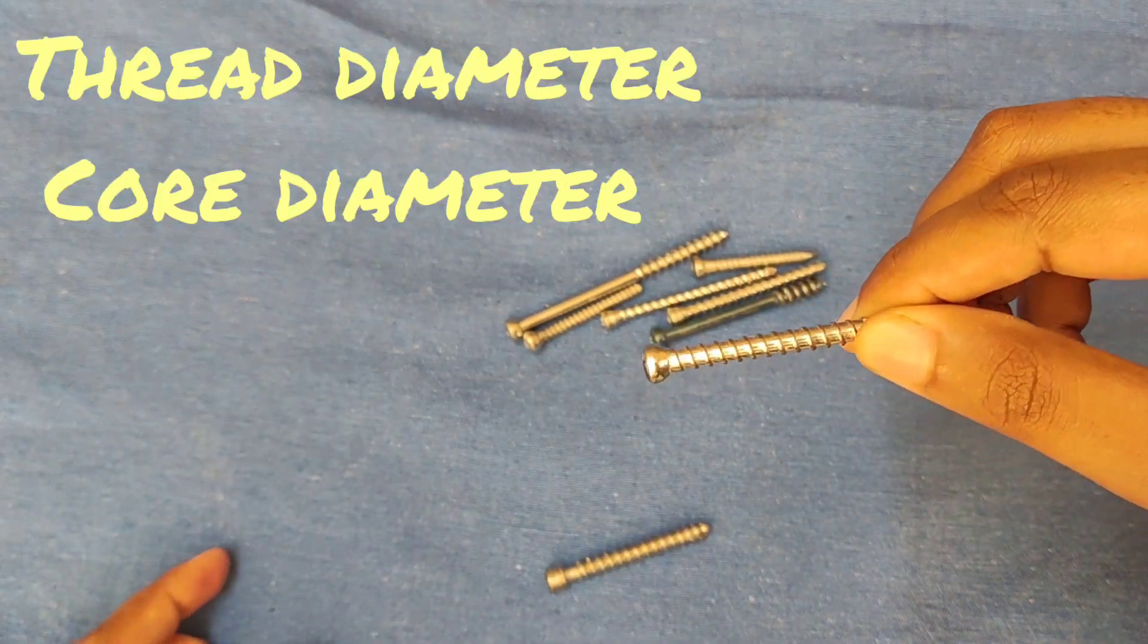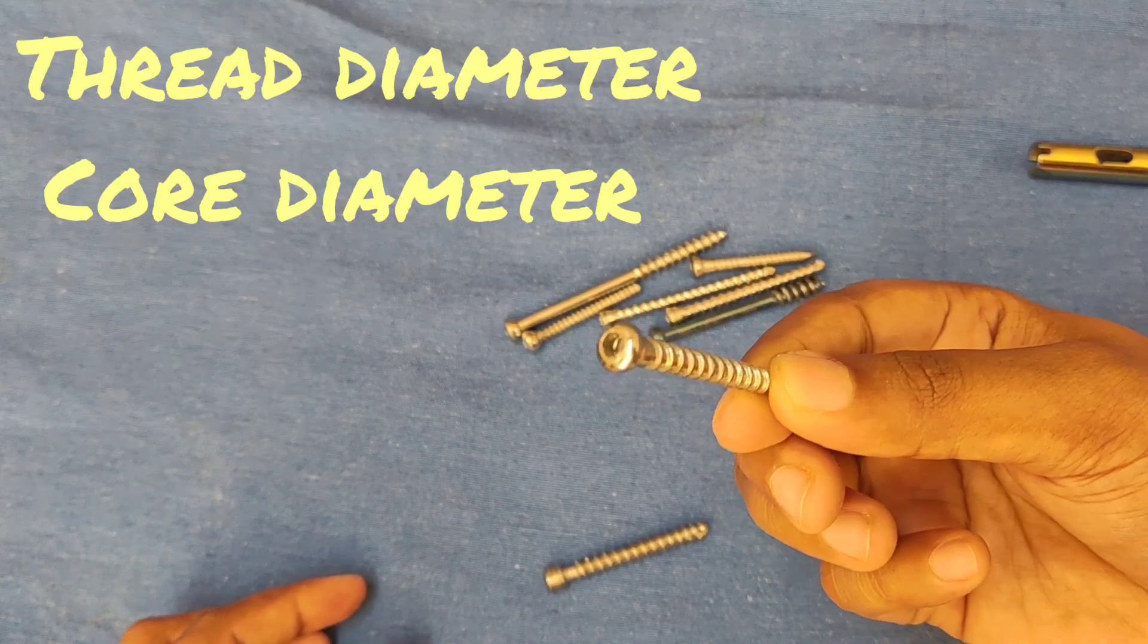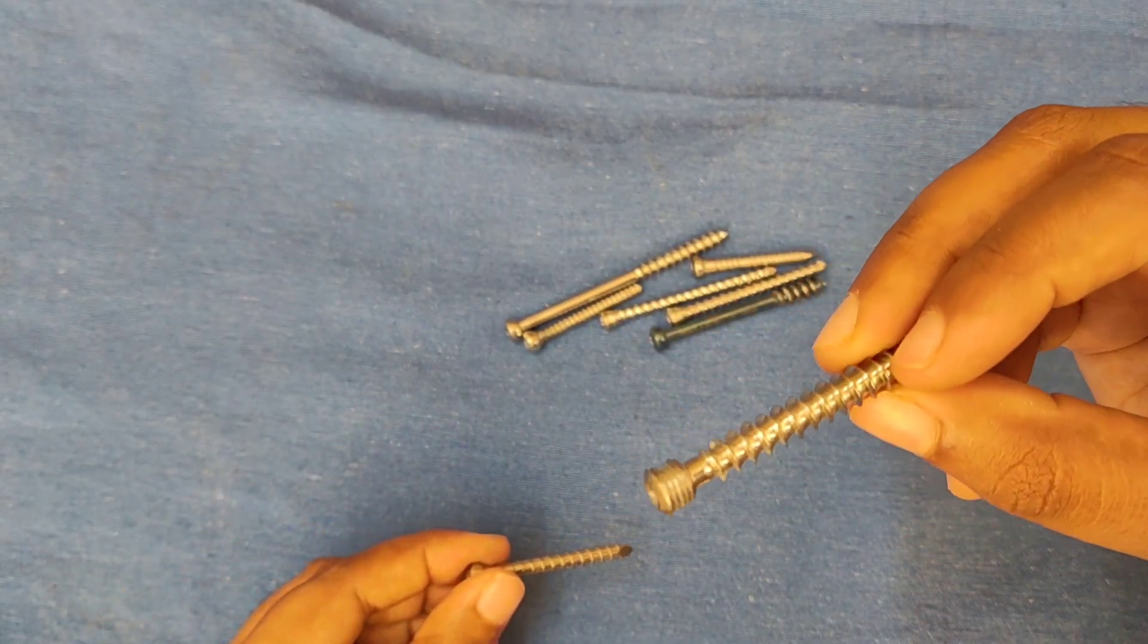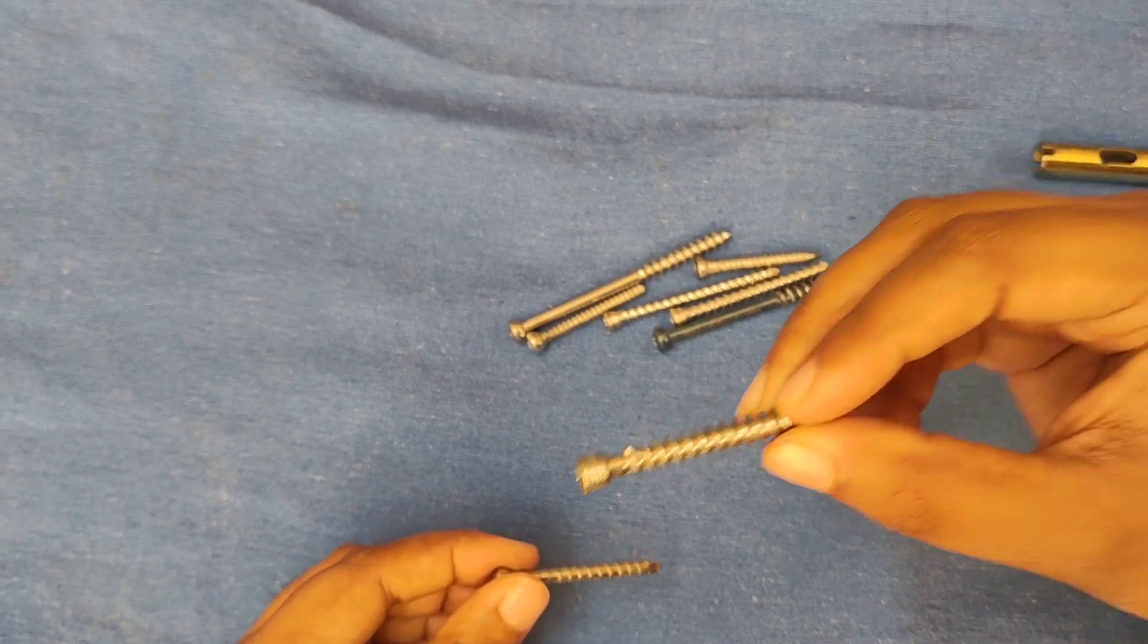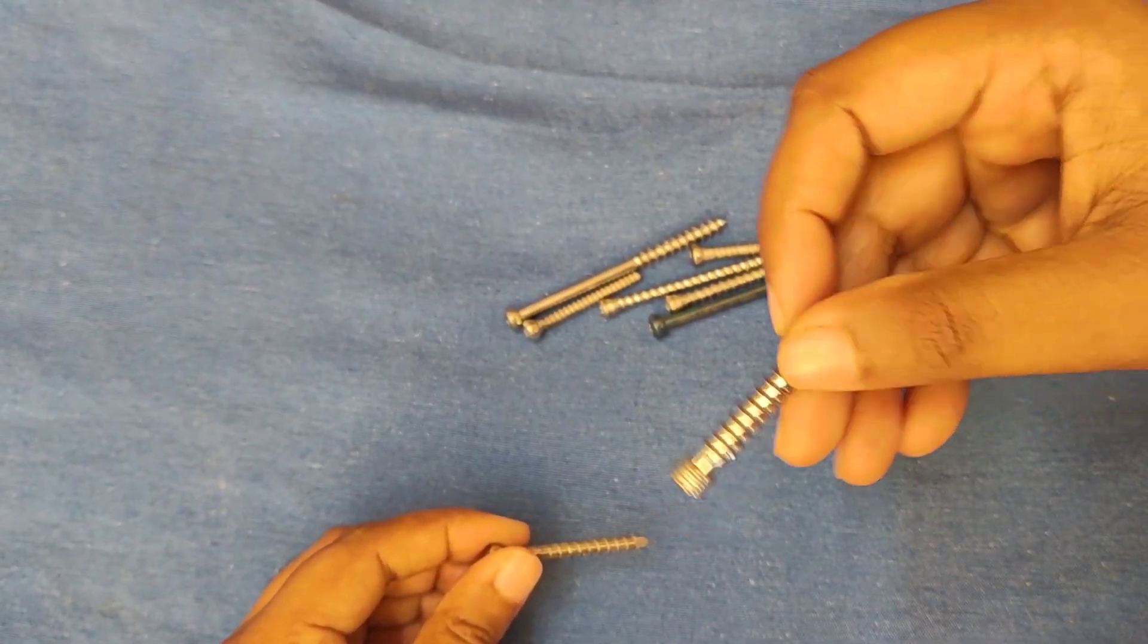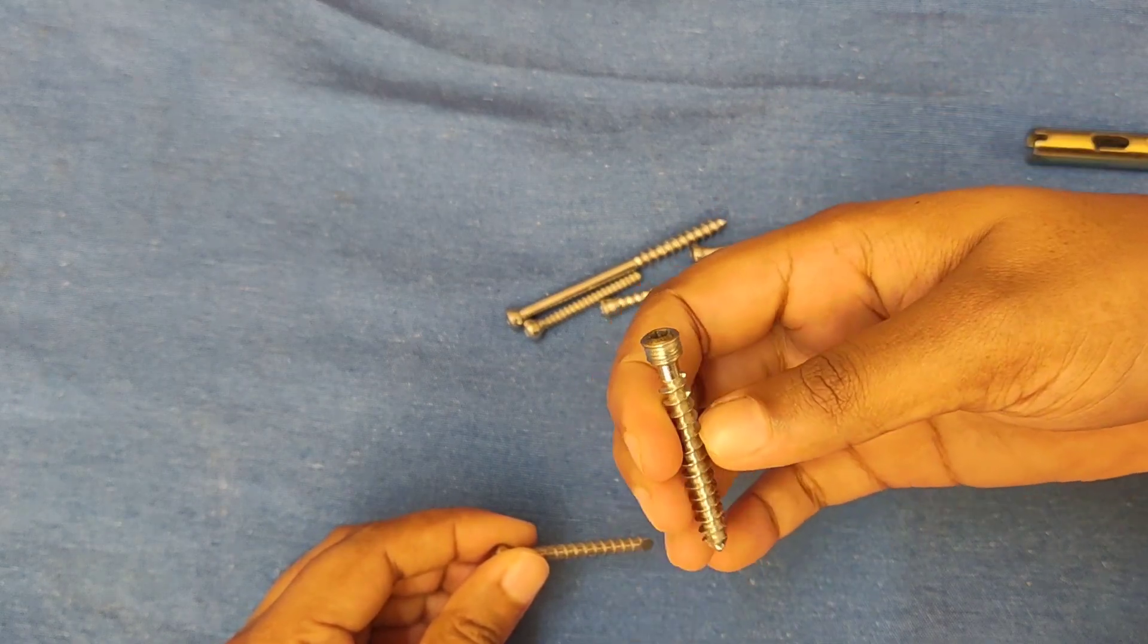Thread diameter represents diameter of screw, and core diameter is the narrowest diameter and weakest part of screw. Pitch is the distance between two adjacent threads. Lead is the distance traveled by screw in one turn.